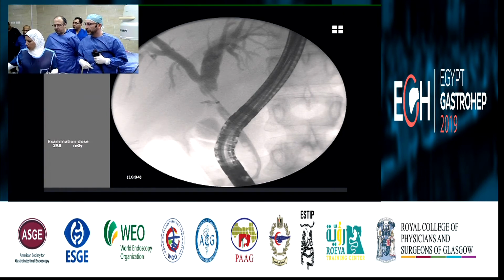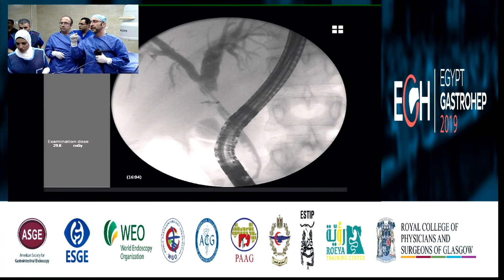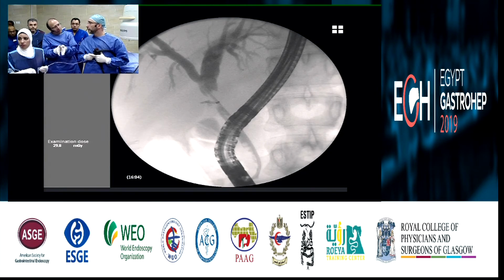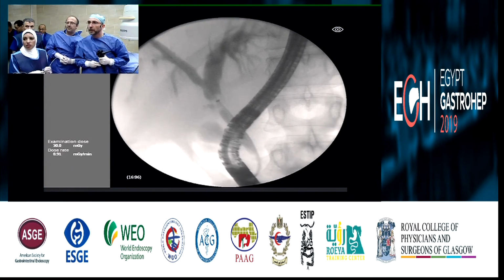Yes. Put that wire, please. Put some saline in first. Is that saline or contrast? Stiffer. Maybe. You know why? Because the distance between the stricture and the confluence is really short. So I think the metal stent could migrate very easily. The problem is if it migrates toward inside the liver. No, it won't. Usually migration is distal. This is different from transplant patients, where there is more room above the anastomotic stricture. Okay, go, push.